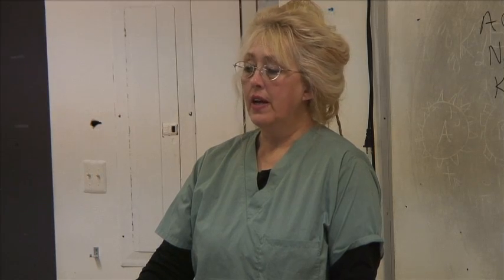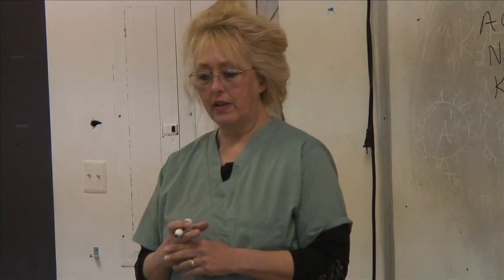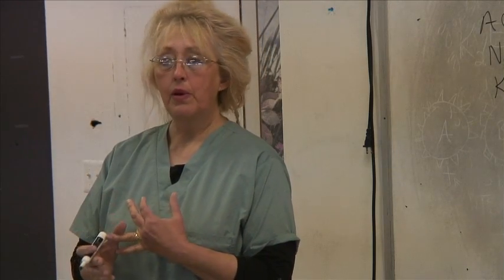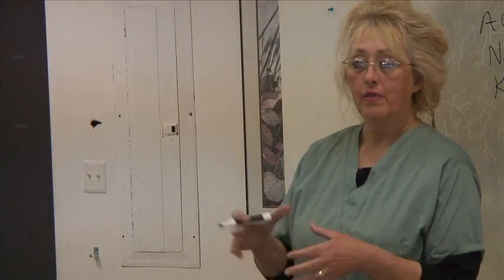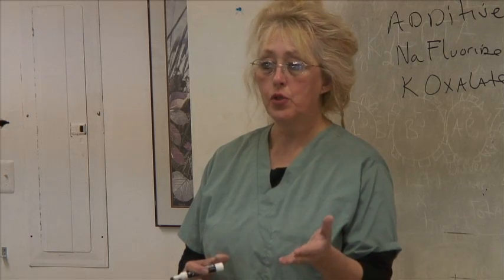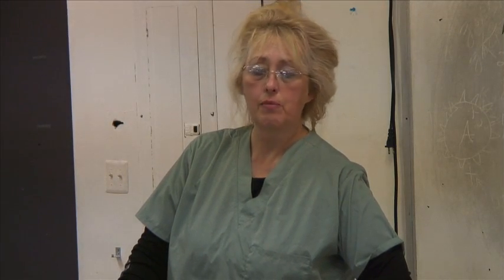Okay. So, for instance, cardiac enzymes and troponin levels, a lot of times those are stat. If someone comes in, presents with possible myocardial infarction, we're going to start them an IV, we'd probably give them some aspirin, probably give them nitroglycerin, we'll give them morphine for pain, we'll hook them up to an EKG machine, we'll have the crash cart on standby, and the doctor will probably order a stat cardiac enzyme profile. You'll come down with your green top tube, with a lithium heparinized tube, not sodium, and what we're looking for is the first muscle protein that is released into the bloodstream when any type of cardiac ischemia takes place, which is myoglobin. Myoglobin typically doesn't last in the body very long. So it's very crucial that the phlebotomist come down to do those stat cardiac enzyme profiles, stat.